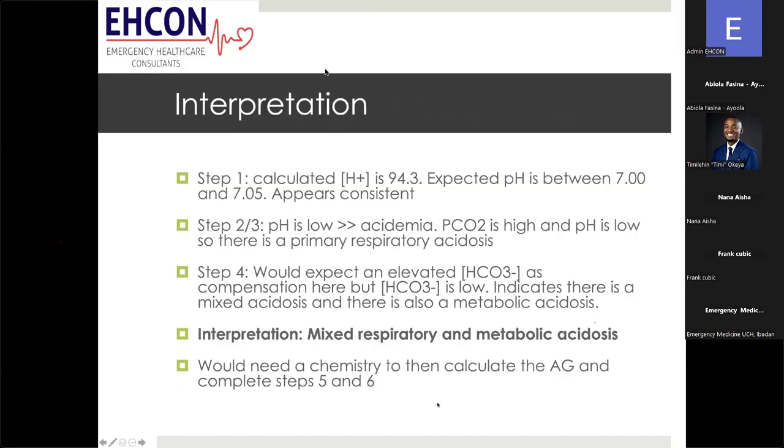Now, if we wanted to go on with the metabolic acidosis, we'd actually need the chemistry to calculate out the anion gap and possibly the osmolar gap. We don't have it, I'll leave it here, but this is just to show you how we should be thinking about these disorders.